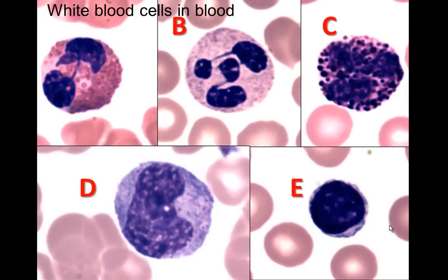Looking at white blood cells in actual human blood, we see the eosinophil with its big eosinophilic granules. In contrast, the basophil has granules that impede our view of the nucleus — it does have a lobulated nucleus and large blue granules. A neutrophil also has a lobulated nucleus but its granules are much smaller than those of the eosinophil or basophil.